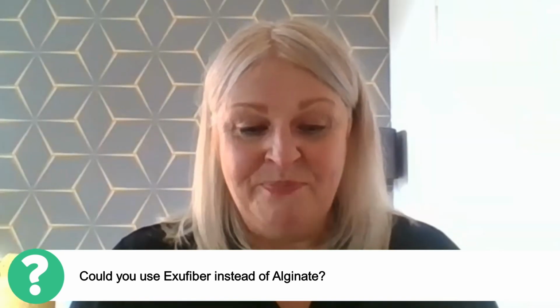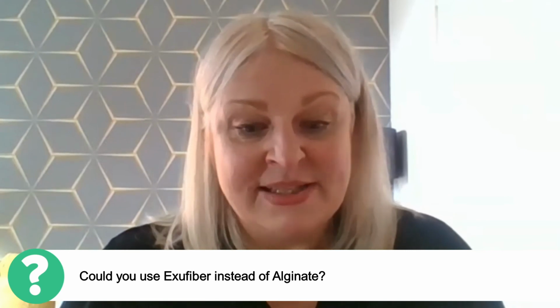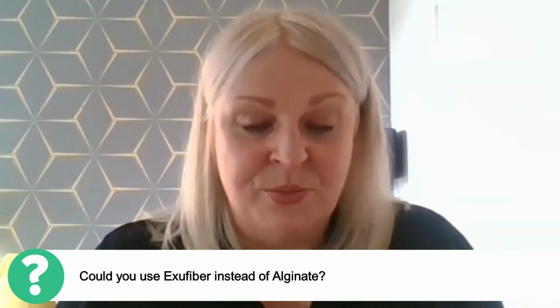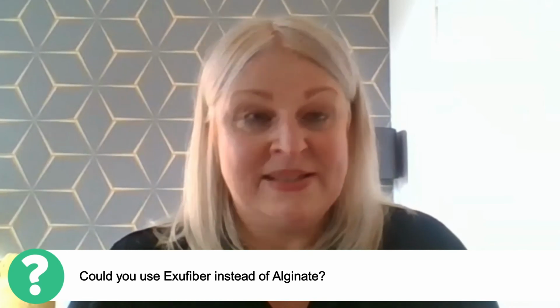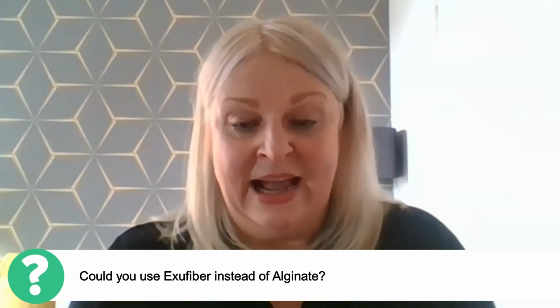Perfect. Thank you very much. This question's for you, Sarah. Could you use Exufiber instead of alginate? That's a really good question. Thank you. So thinking back, alginates were first introduced for exuding wounds back in the 1980s, and gelling fibres were developed as the next step up from that in the 1990s.